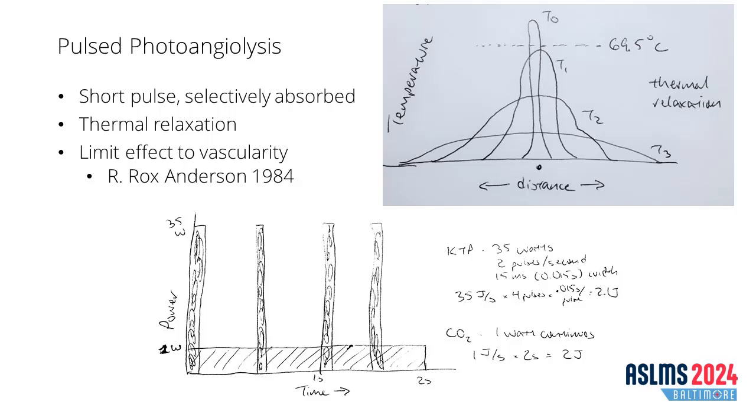And as we know, with my best attempt to draw pictures similar to what I learned from Steve Zeitels, who first pioneered photothermolytic lasers in laryngeal surgery, and he learned from Rox Anderson, it's all about dialing an effect as it relates to cooling of tissue between pulses and selective absorption of your laser energy by the oxyhemoglobin in the superficial layers, the vascular layer, the blood vessels on the surface of the epithelium of the vocal folds in order to limit scar beneath that layer, okay?